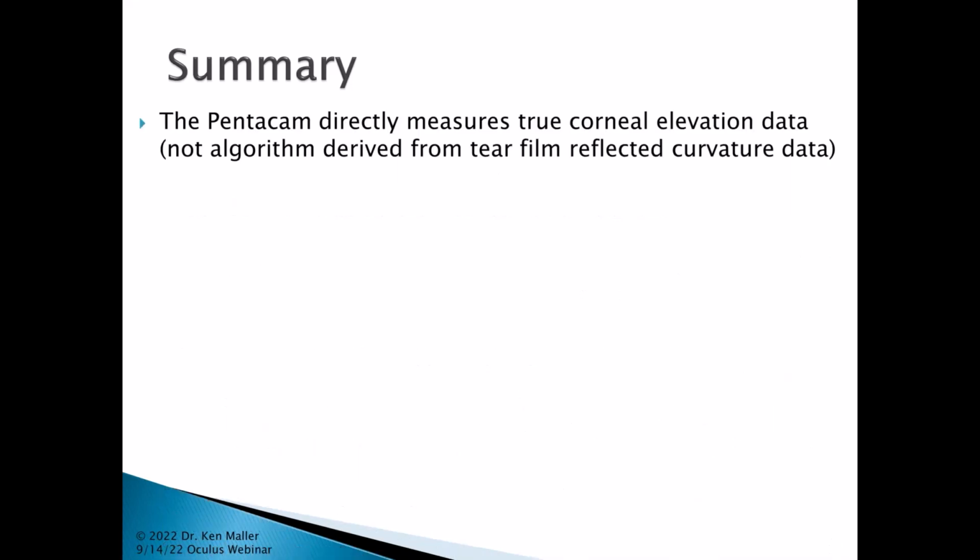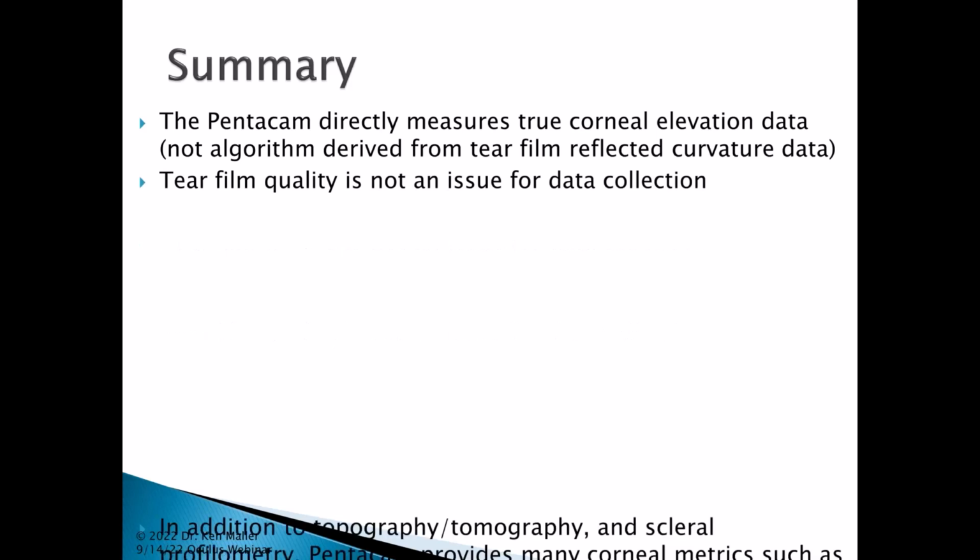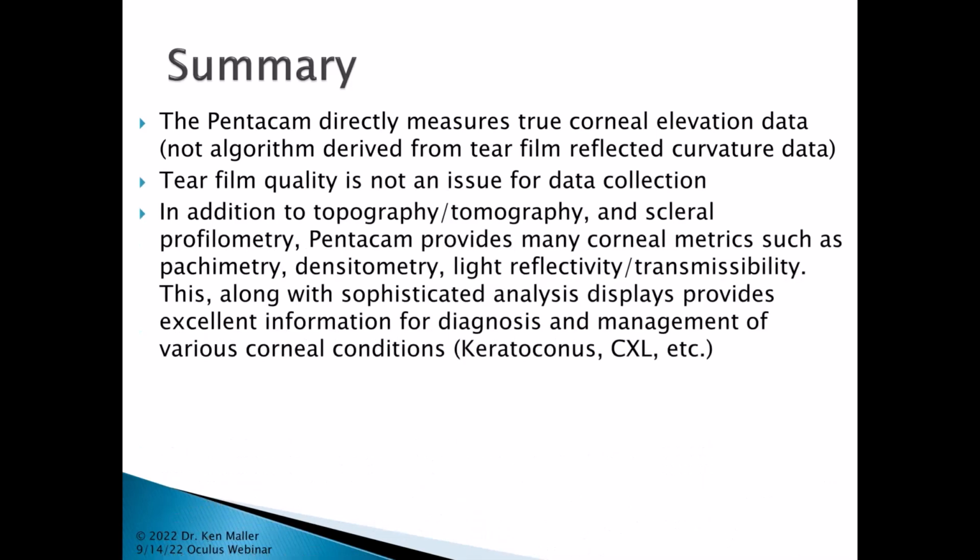The Pentacam directly measures true corneal elevation data. It's not algorithm derived from tear film reflected curvature data, such as in Placido disc or even some of the other scleral elevation measurement devices. Tear film quality is not an issue for the data collection. It doesn't play any role whatsoever.